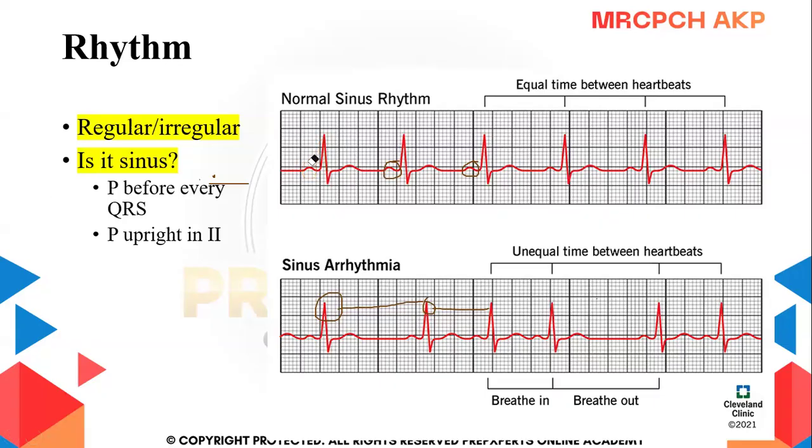Okay, so I hope this rhythm part is clear, because in the coming scenarios I'll be asking you to see for the rhythm whether it's regular or irregular, and I want you to contribute, because ECG without contribution will not be a fun thing. Okay, so coming to the next slide.